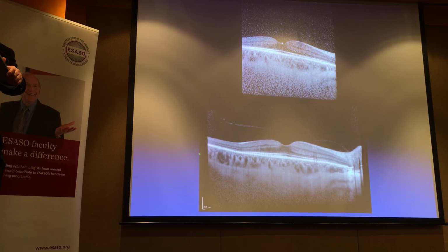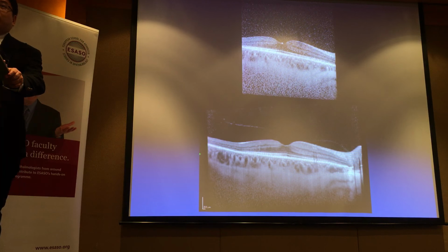Okay? And decide what's good for you, for your practice, for your type of patients. And do not be afraid to send them back for a repeat scan. Because it's a short walk, I think, and it's only a few seconds to perform a scan. So if you're in doubt, do not hesitate. But depending on what you're looking for, you need to look very carefully, right?